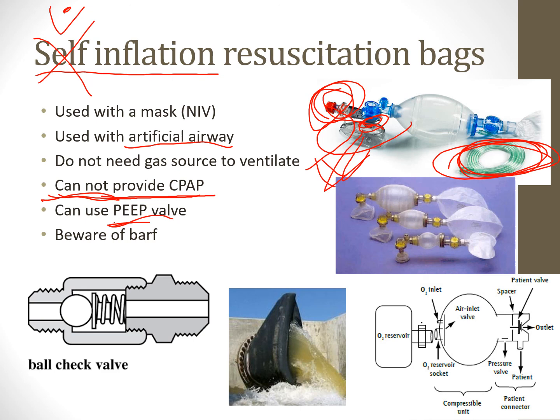The big thing here: if the patient does somehow experience some vomit, you might have an issue and have to change the bag. Suction every time. You want suction available running. A good Yankauer is a lifesaver as well.